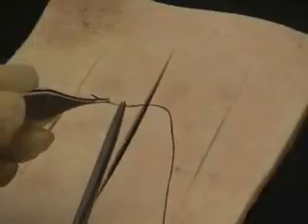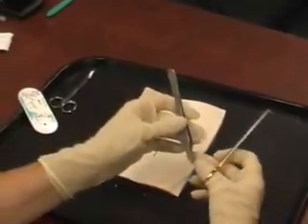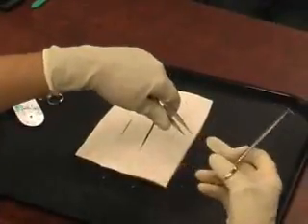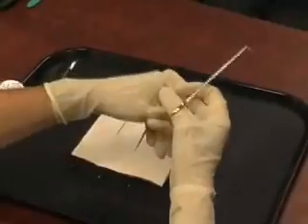Okay, I'm trying to get as close to the end as I can. Okay, so that's the position of the needle driver and the needle within the needle driver. The only thing that you have to worry about with regard to the hand is that some of you are going to naturally just hold it like this. If you cannot see the butt of the instrument, this is incorrect. So you want to try to see the butt of the instrument, this part up here.